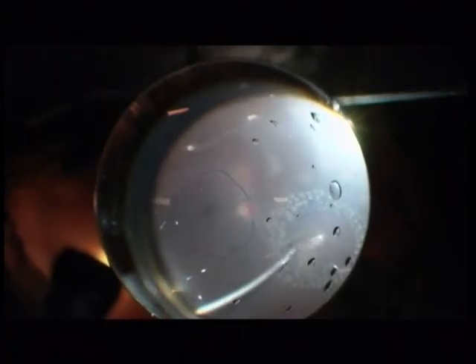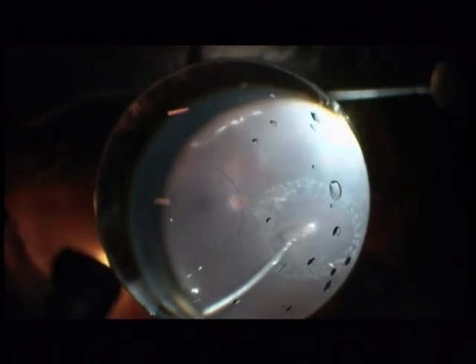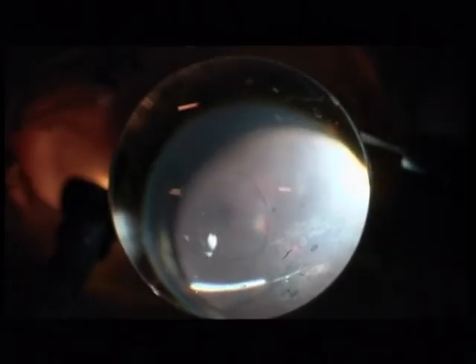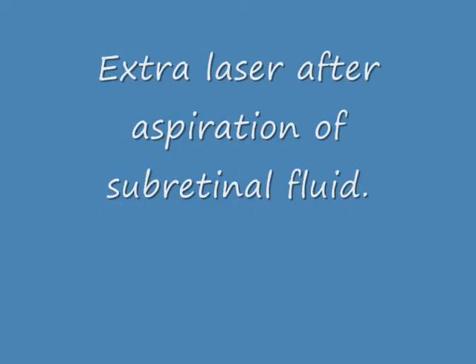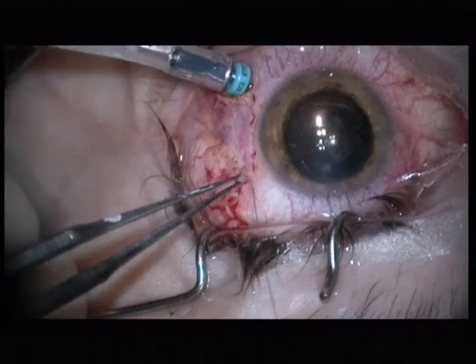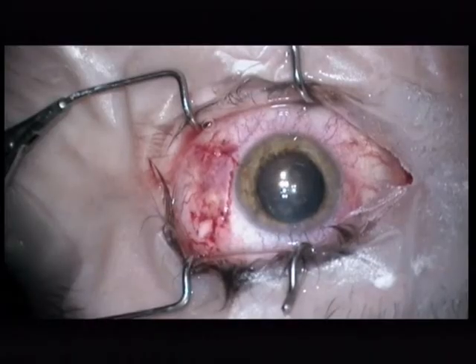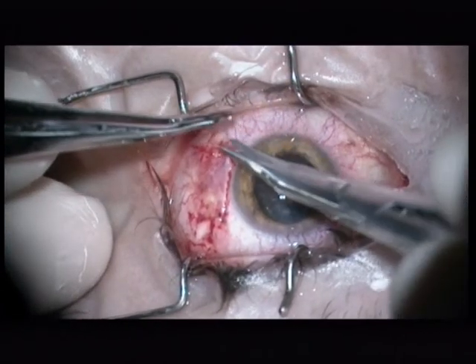I will only use a gas tamponade here — no silicone oil. There is no silicone oil necessary in a delayed vitrectomy, because I removed most of the subretinal fluid. So laser is now possible because the subretinal fluid is removed. There will be a C2F6 tamponade. And this is the final touch.